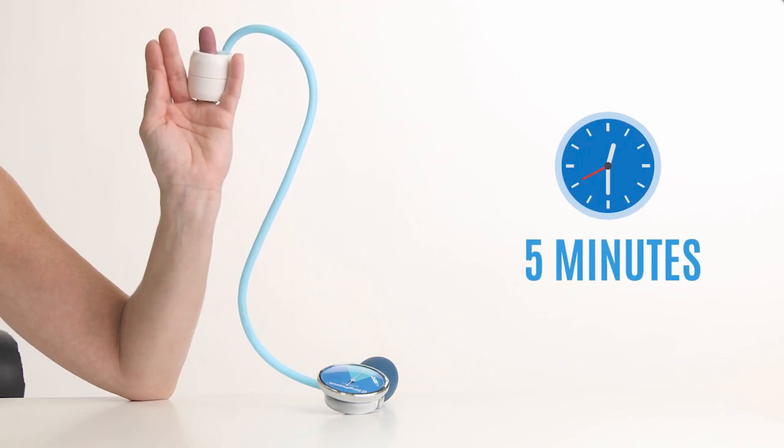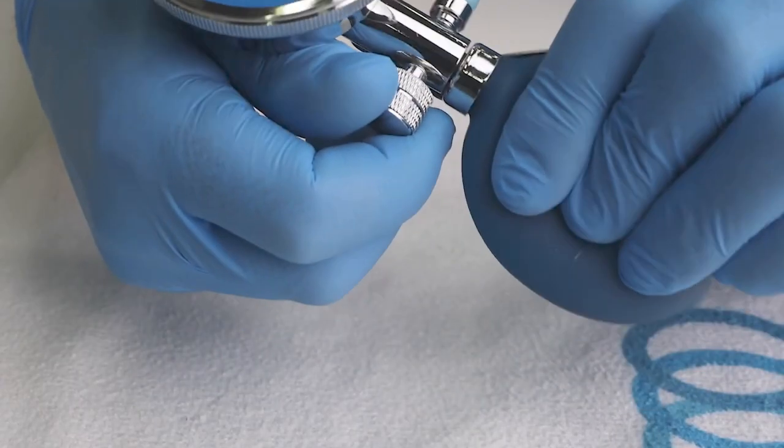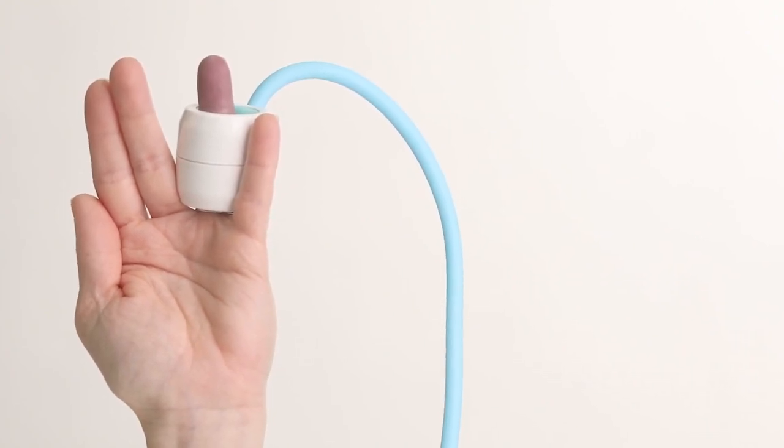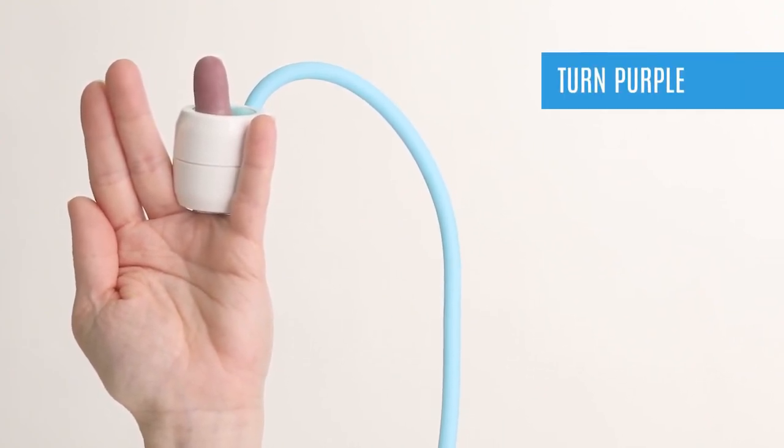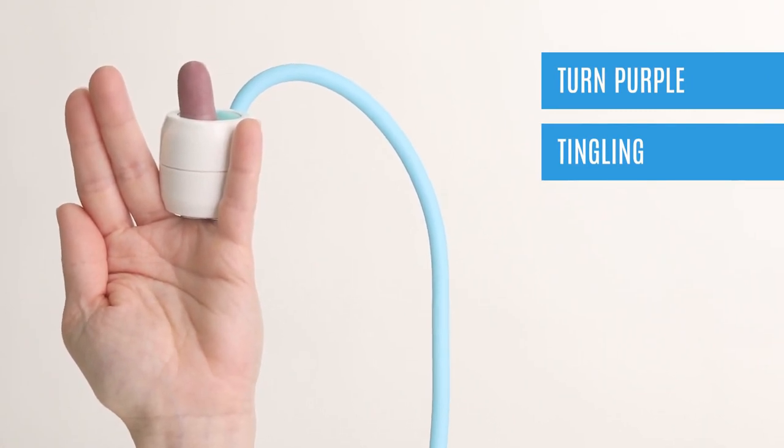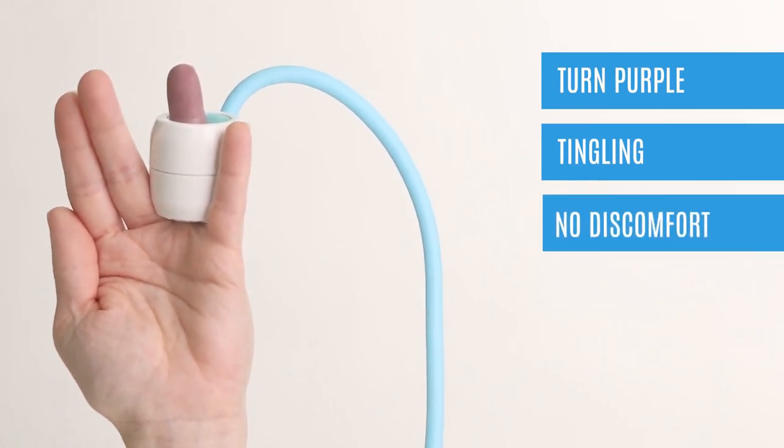The dial may fall out of the target zone area. Simply reapply more pressure to bring it back to the target zone. During this time, you may notice the person's fingertips turning purple and they may feel a mild tingling sensation. This is very common and will return back to normal when the device is removed. The individual should not feel any discomfort during this process.